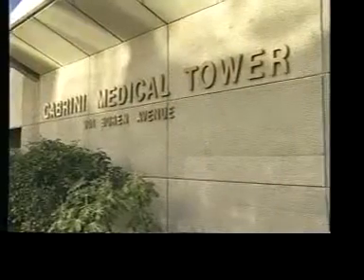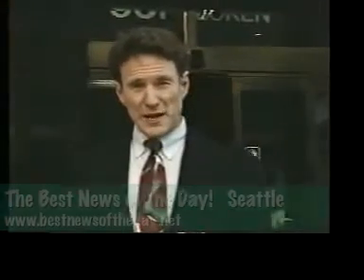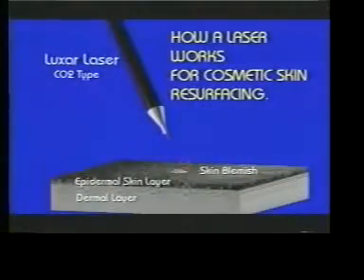This is Seattle's Cabrini Medical Tower, home of Dr. Phillip Haeck, a board-certified plastic surgeon who has been performing many of his procedures with a laser. The laser is a carbon dioxide beam that's energized to the point where it can evaporate tissue that has water in it. All it does is superheat the water inside the cells, literally making them evaporate.